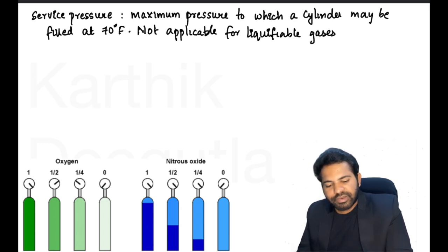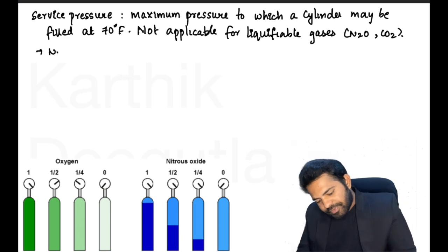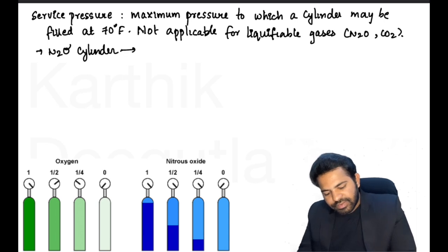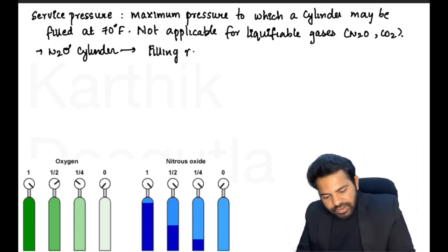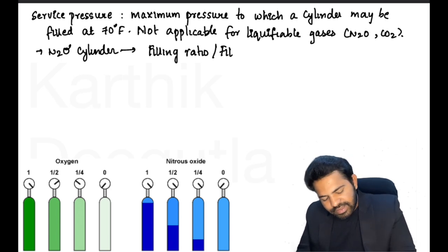What are the examples of liquefiable gases? Nitrous oxide, then carbon dioxide. So for the nitrous oxide cylinder, there is a special entity by which it is filled. This is known as the filling ratio, or it is also known as the filling density.